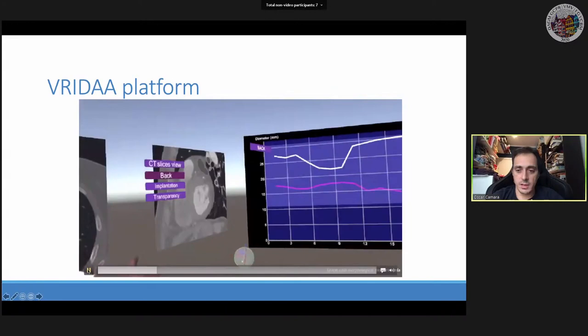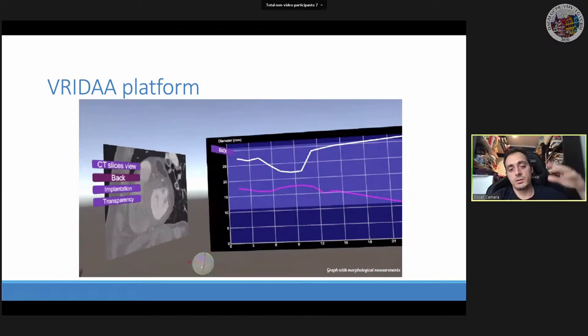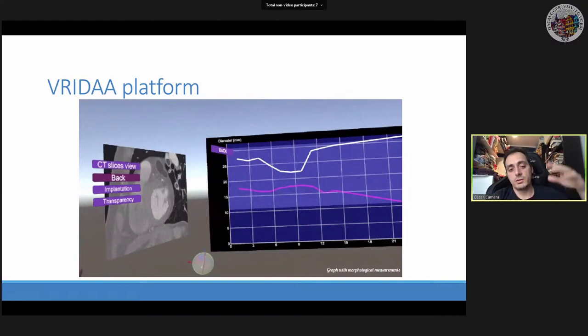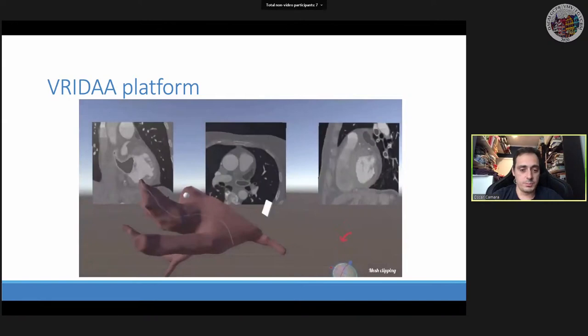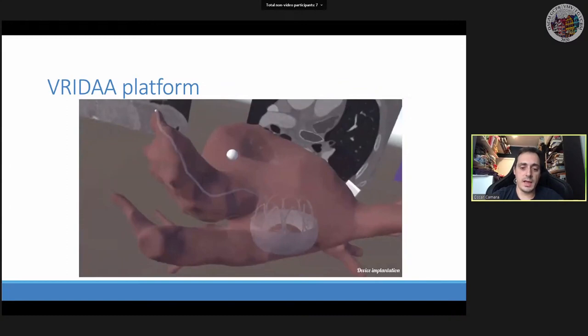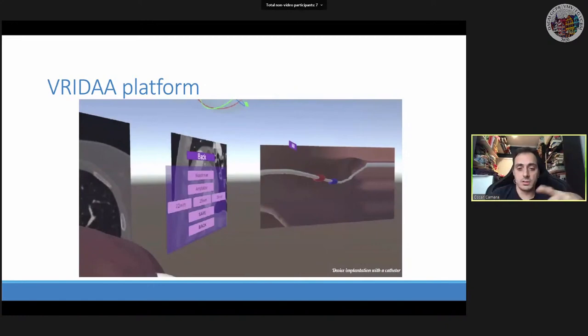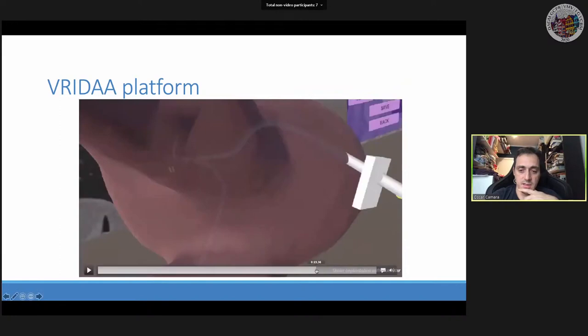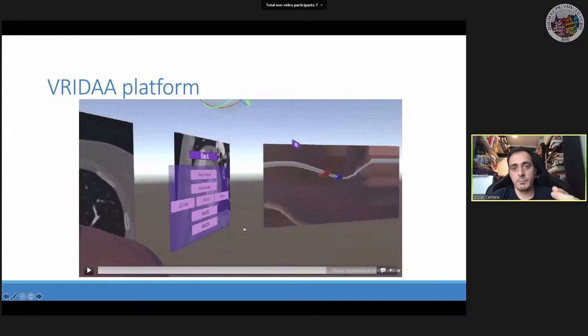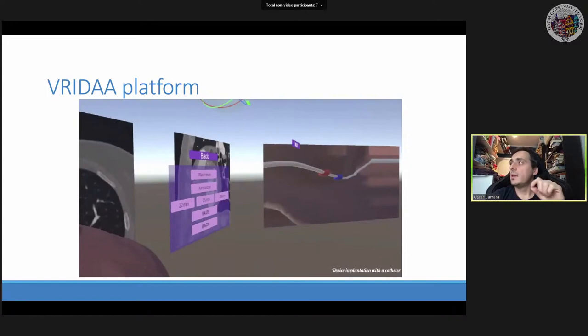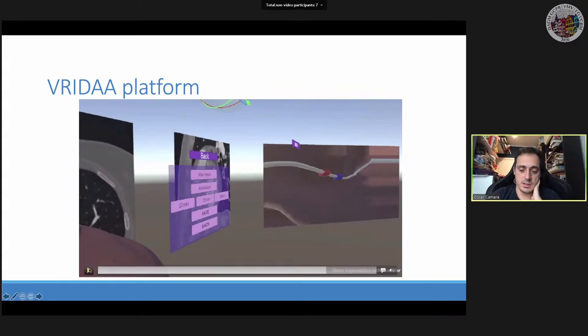We've implemented different options for clipping and transparency to browse within the anatomy, and can display different device types with different sizes along the geometry. We also have an endoscopic view — similar to the previous talk — because for parts of the intervention the clinician needs to visualise the approach through the atria. This endoscopic view is not available with current visualisation tools and is something quite appreciated.